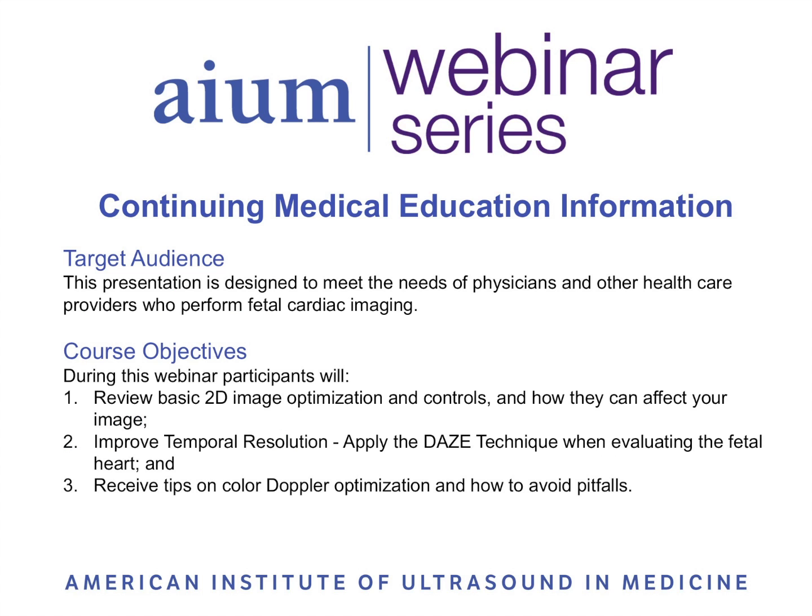By the conclusion of this webinar, participants should be able to review basic 2D image optimization and controls, improve temporal resolution by applying the DAZE technique when evaluating the fetal heart, and receive tips on color Doppler optimization.